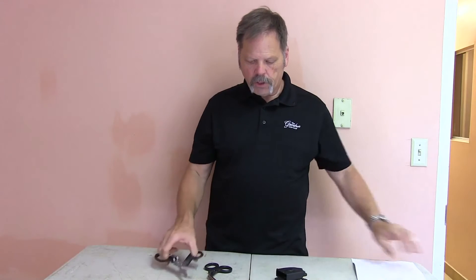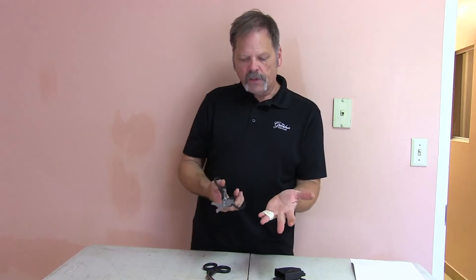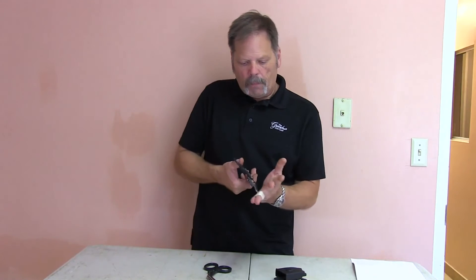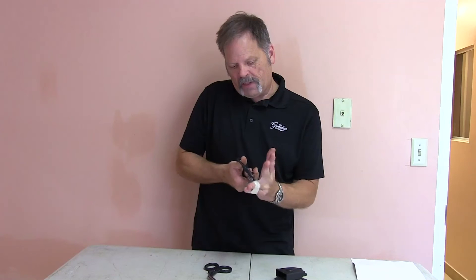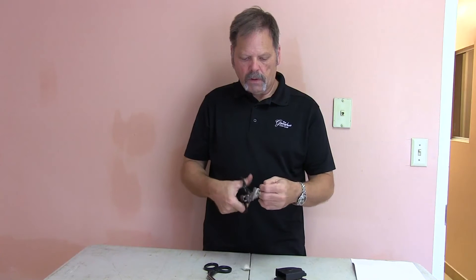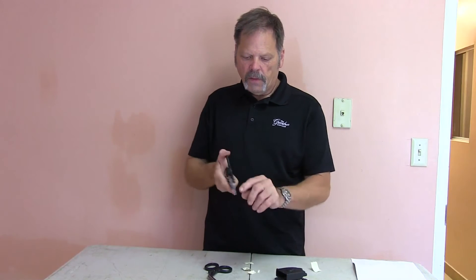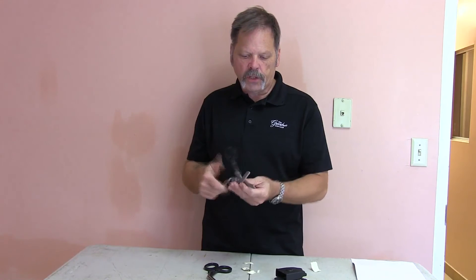Let's see how well it cuts — of course paper is no issue. I've taped my two fingers together just for a demo, and it is a very thick blade which is good for strength, but I'm finding it's a little tight to get in here. Sometimes thick isn't the best thing, but it's cutting this tape very nicely, not an issue. The anvil part of this blade is very finely grooved so whatever material is on there is going to stay and be held in tight position for the cutting blade.